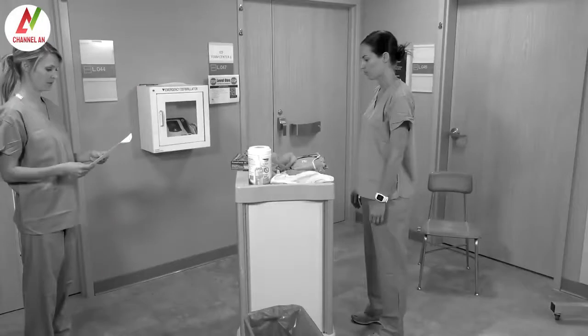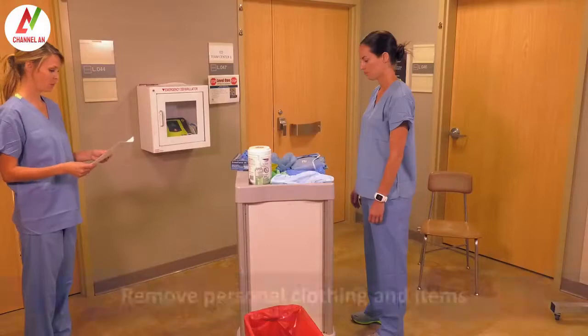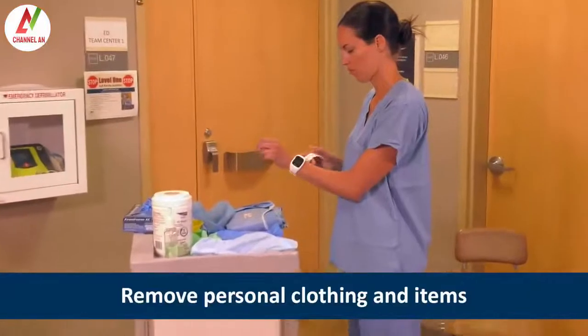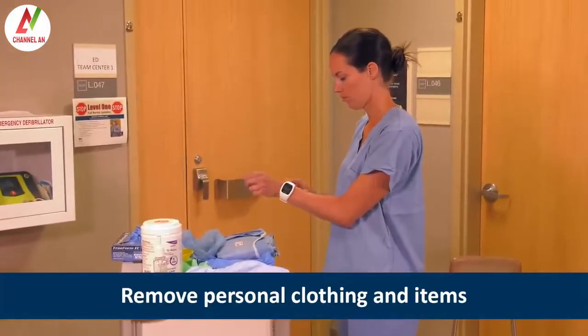Angie is a trained observer, and she will read the steps out loud while Heather dons the PPE. Heather starts by removing personal items like watches, cell phones, and pagers. Long hair and eyeglasses should be secured with a tie.